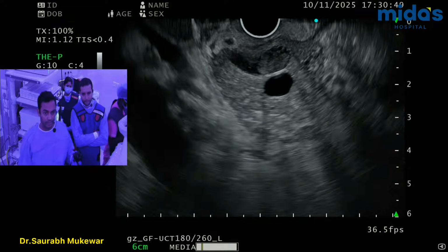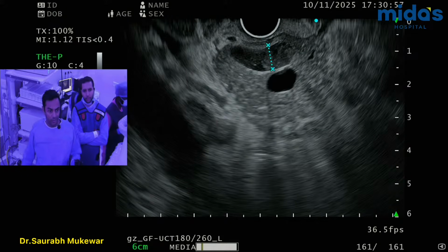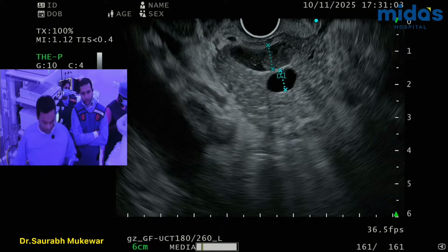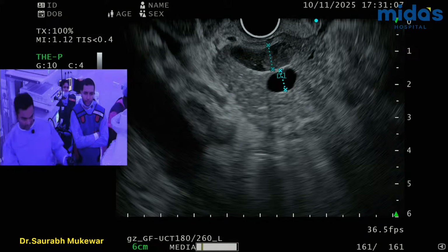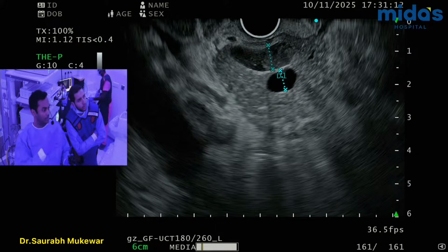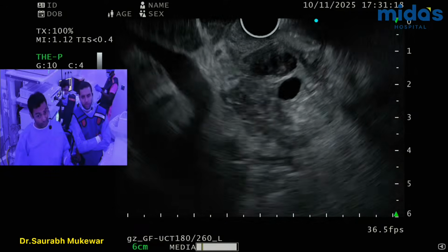So bile duct above, pancreatic duct below. So bile duct is not huge, 7.4 in the intrapancreatic portion. Then MPD is 6 mm. And this is not a good angle. You see here the scope the way it is. You can see on the screen up there as well. So it's not a perfect angle for us if we are targeting, because it's pointing more. It's good for rendezvous in this case.